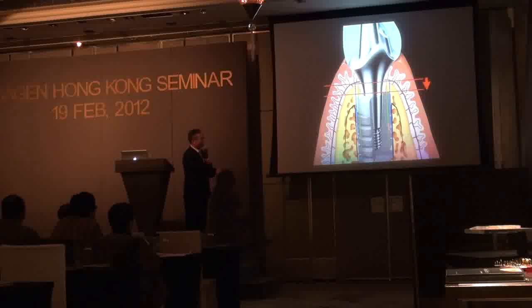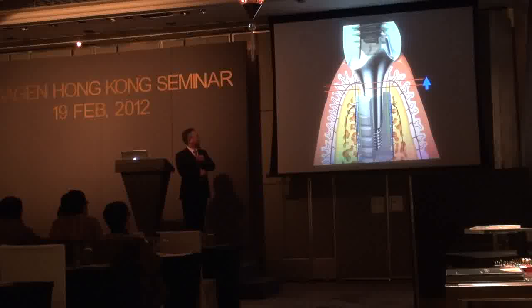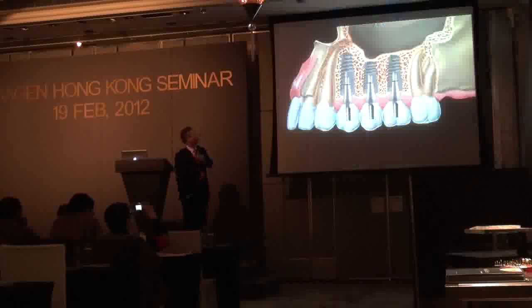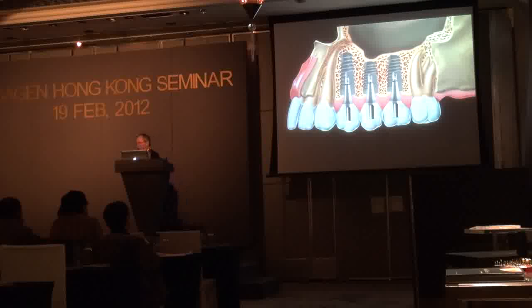I try to utilize this area of bone by making threads here. And then again, I don't want to place implants so deeply. Just 0.5 to 1 millimeter deep is good enough to make a really ideal tissue response, a crestal bone response. So this much is good enough. Looks similar, but different. This diagram was made by Anykylos again.